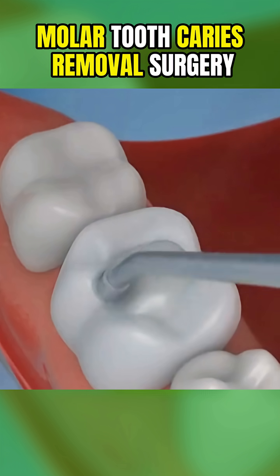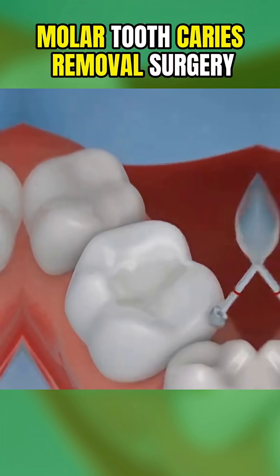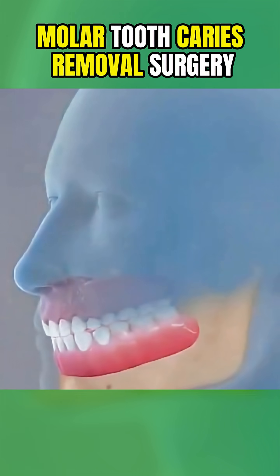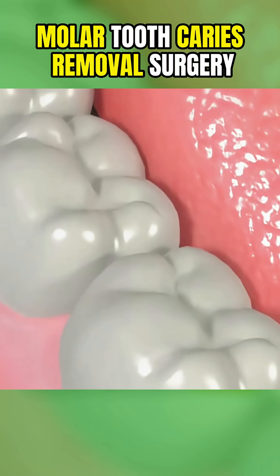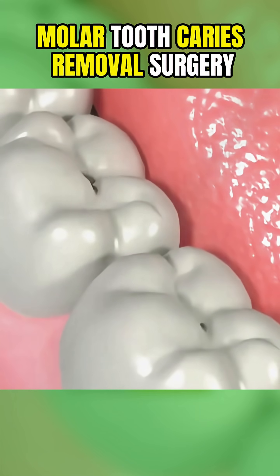After placing the filling, the dentist shapes and polishes it to fit the natural contours of the tooth, ensuring a comfortable bite and smooth surface while preventing future cavities or further tooth damage.